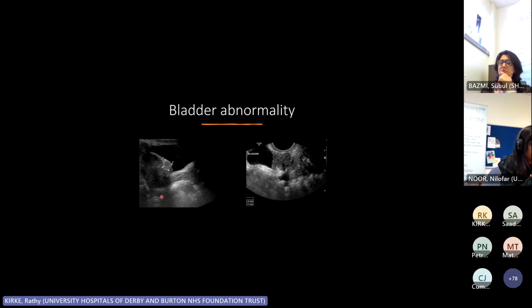Beautiful images, but really difficult to interpret, unsure what this could be. On the transvaginal ultrasound, a grayish, hypoechoic area, not completely as dark as fluid, between the uterus and the bladder. It was an irregular, intermediate echo area, which was really non-specific. It was avascular, very difficult. This was called a hematoma.